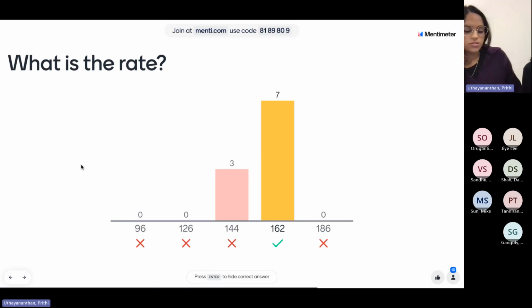because usually it's quite easy to do 6 times the number of QRS complexes, especially when you get flustered in an OSCE and are trying to count in between, figuring out if it's regular or irregular. They usually give you a calculator, I think, so you can just type it in. I always think it's easier to count the rhythm strip.